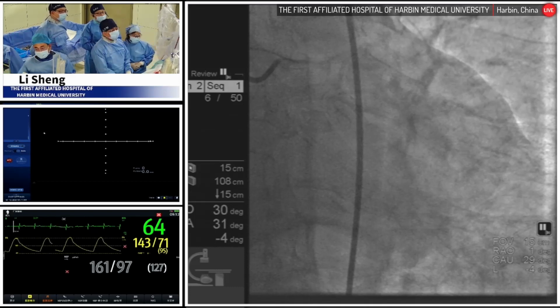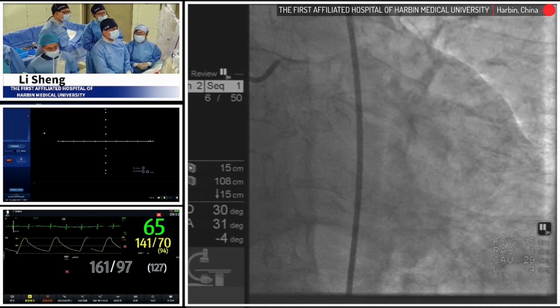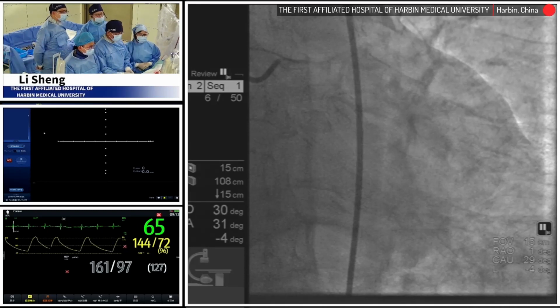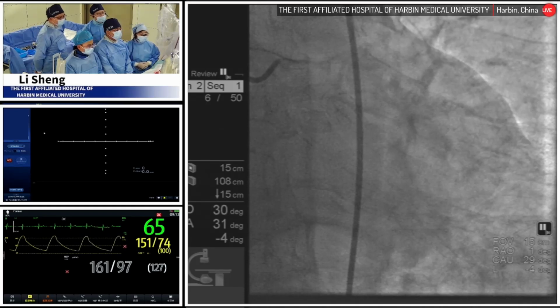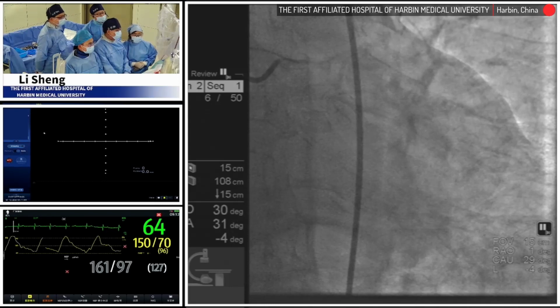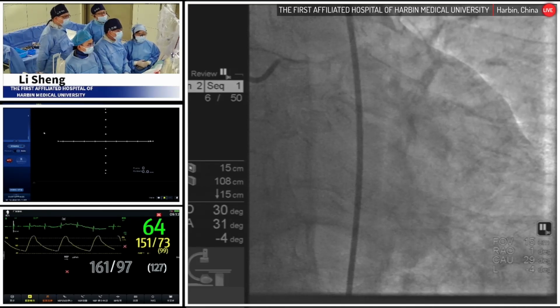According to the characteristics of the lesion, we decided to use QFR for functional evaluation. If we implant the LAD to LM crossover stent, we will check the QFR of the circumflex again. According to this data and the angiography results, we then decided what to do next.